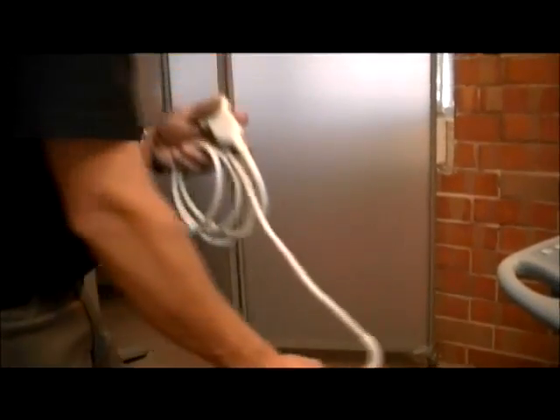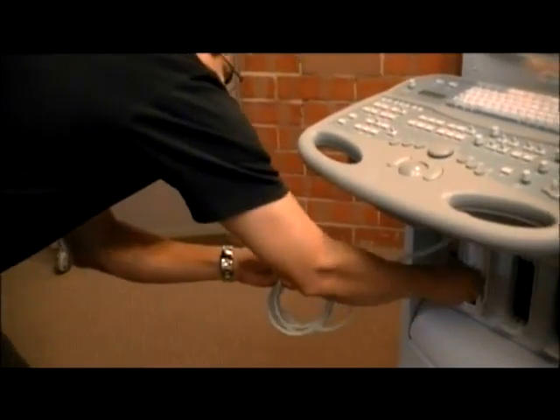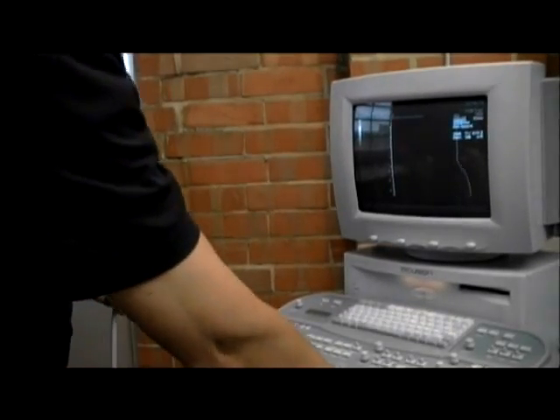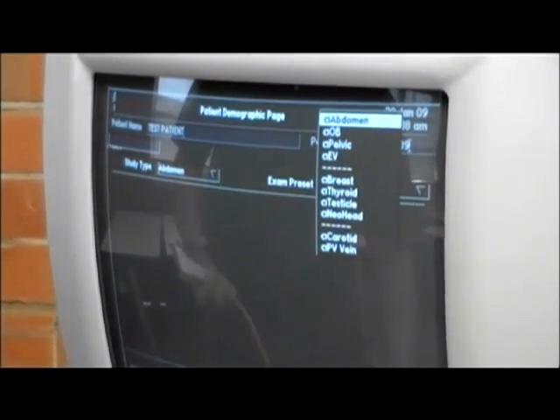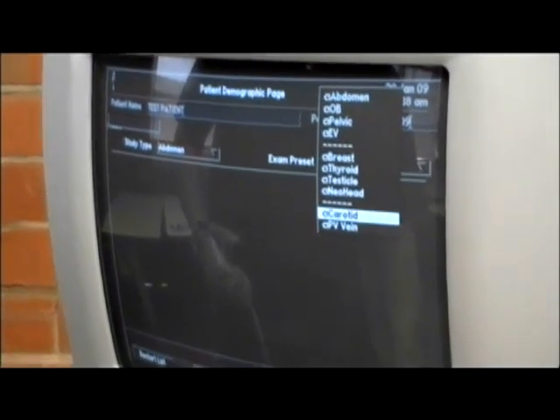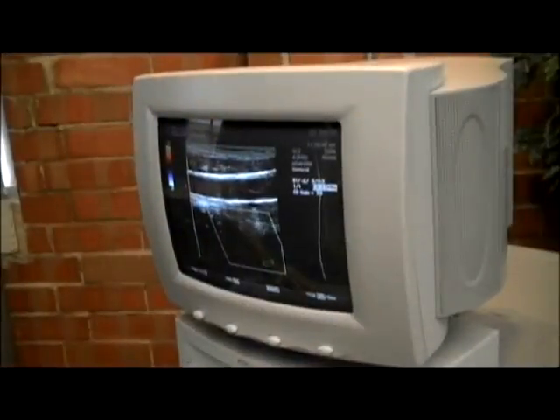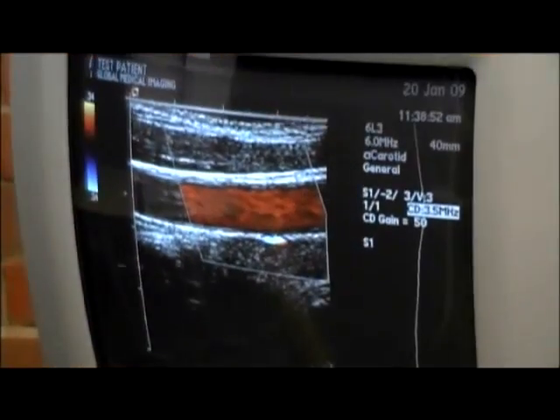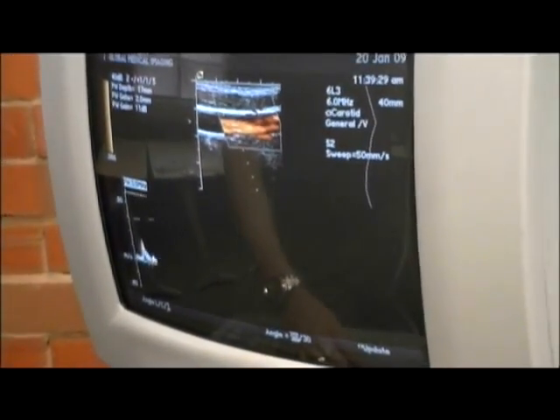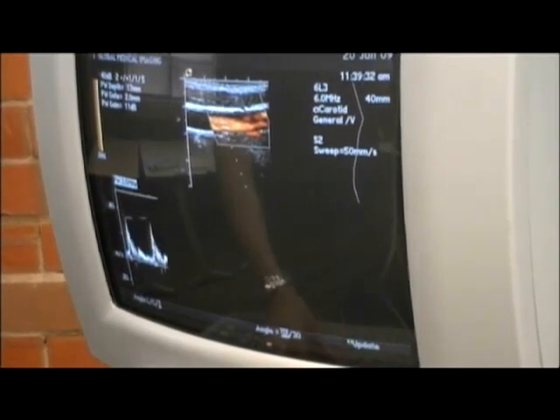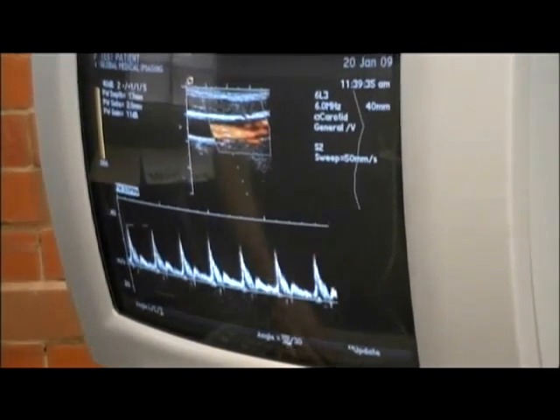Now is a good time to pull out your probes and test them. Test the ultrasound equipment to ensure it was reloaded properly. Press the begin and end button. Assign an ID of test patient on the patient demographics page. Use the proper preset for your probe. For this particular probe we will use a carotid preset. Make sure everything looks and works normally with your system by going through all the available modes, and from there review your data as if it were from a normal patient. This will ensure that your software reload for your Accuson Sequoia was executed properly.